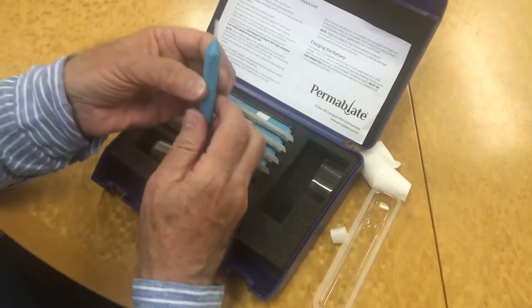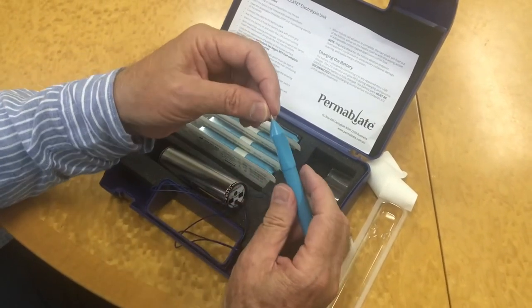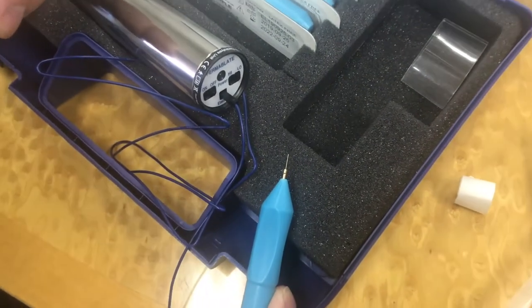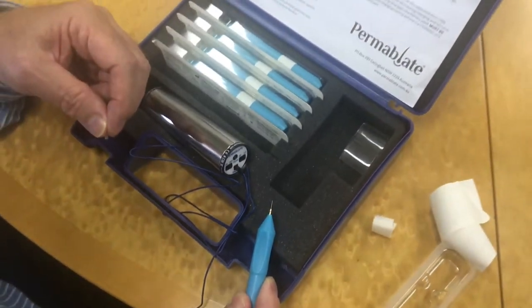The sterile single-use electrolysis needle is micro-fine and gold-plated, allowing for smooth and accurate insertion alongside the hair into its follicle.